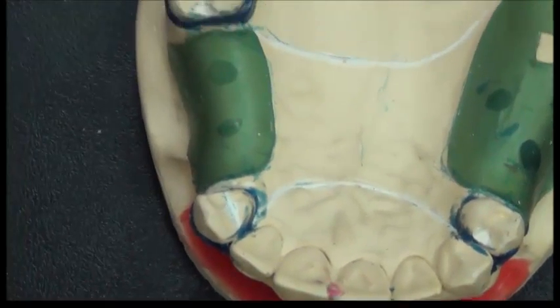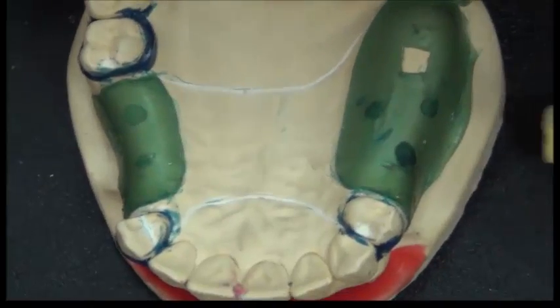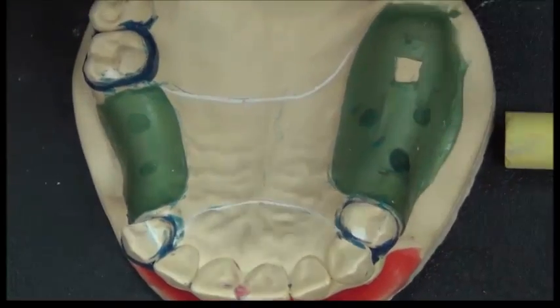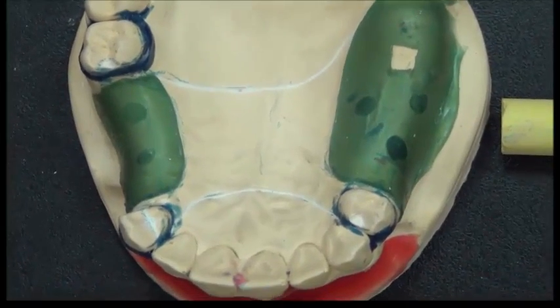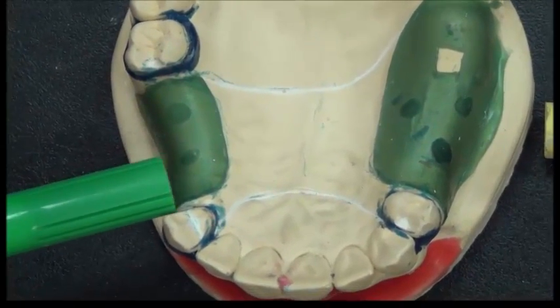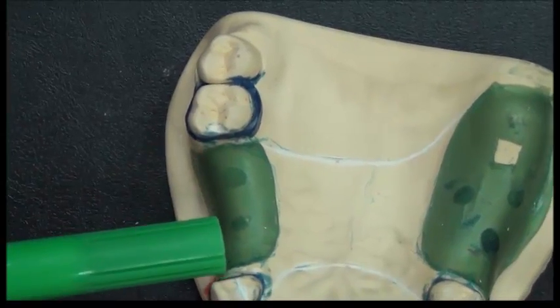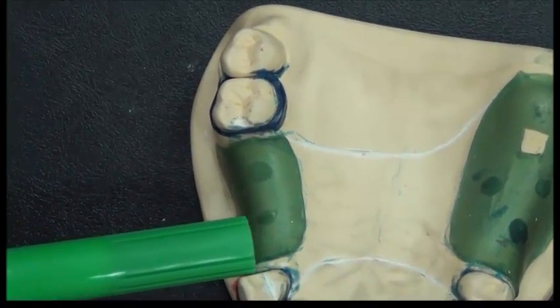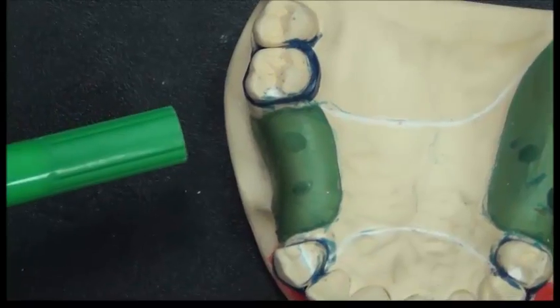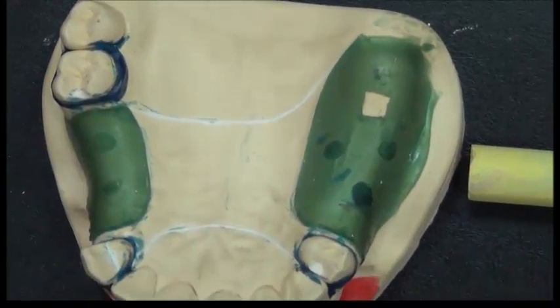You will take those in detail in your lecture. Here we also use our surveying instrument, where we remove the excess wax on the proximal surfaces, to make sure that this proximal surface with the blockout are all parallel to the path of insertion. So here we use the wax trimmer step.